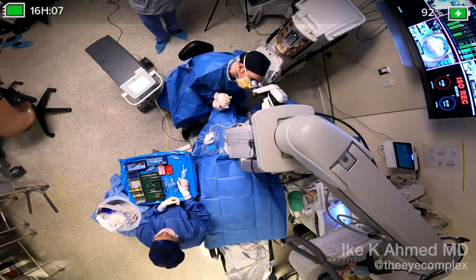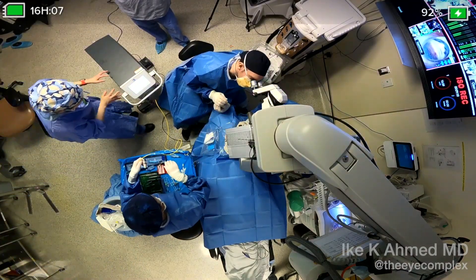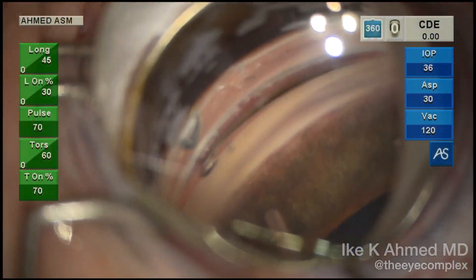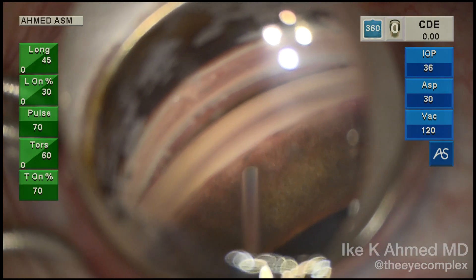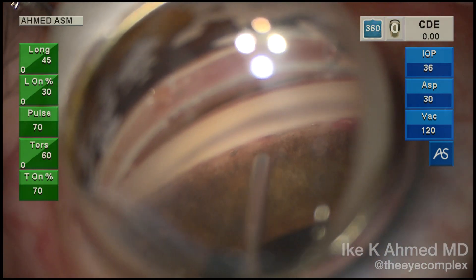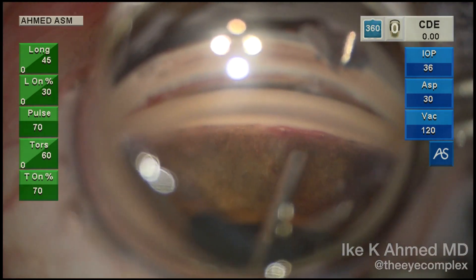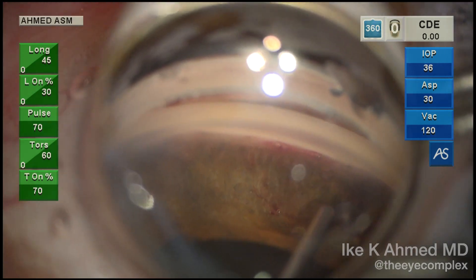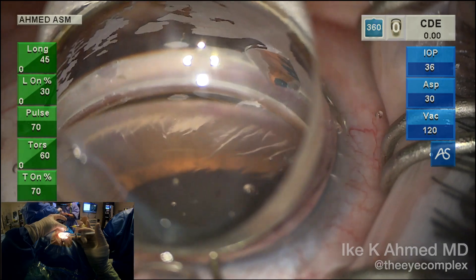We will hand off the probe and now look into the angle, injecting viscoelastic just to visualize those ostomies that have been made, and we'll see nicely how they are spaced apart. You can see the openings, a little bit of air bubble formation which is normal, some gas bubbles, and in some cases the evidence of the back wall of the sclera — that white pearly color coming through the ostomies — showing a full thickness result.